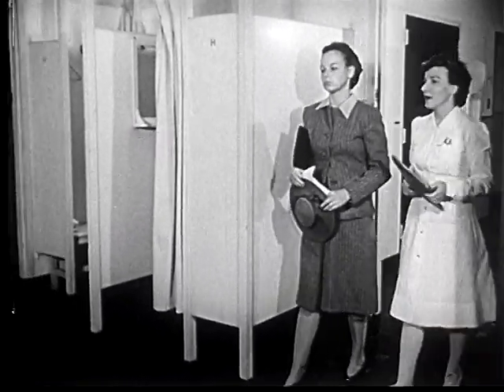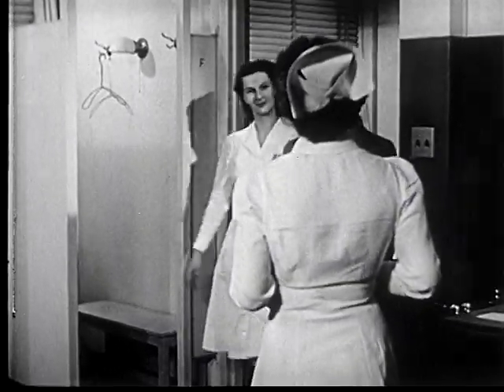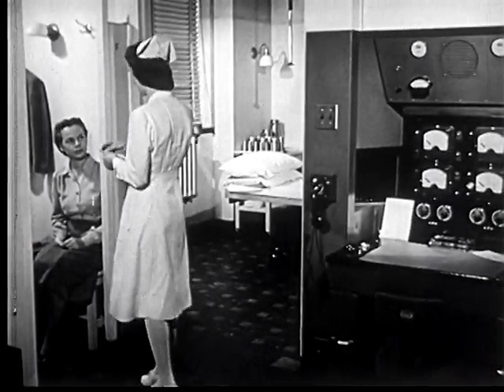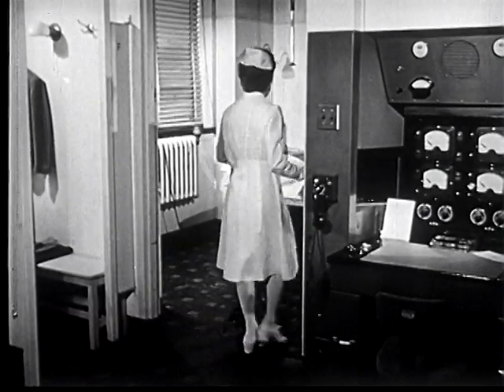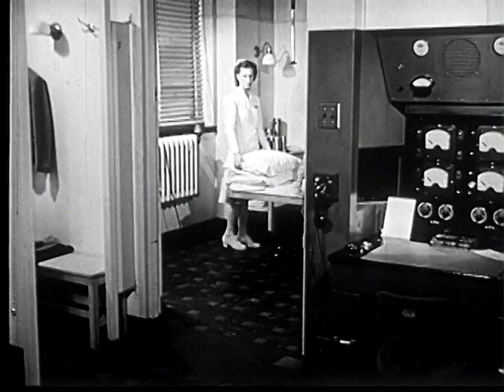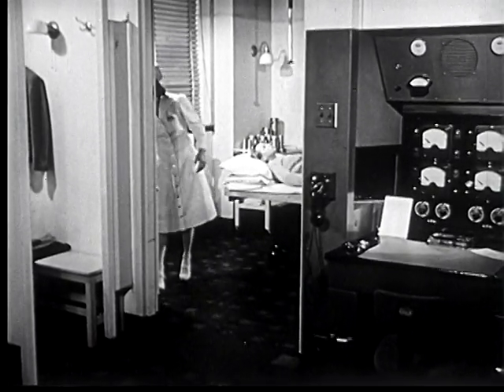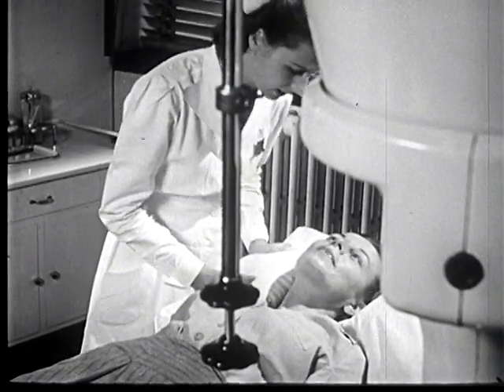When the treatment is to start, Mrs. Gordon's nurse introduces her to the nurse technician, who tells the patient how to prepare for the treatments. As Mrs. Gordon lies down, the technician again reassures her about her first treatment. The patient is made as comfortable as possible and instructed that she must not move during treatment. Sandbags provide firm support.